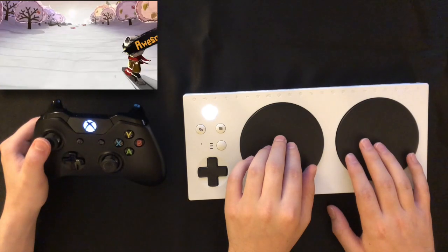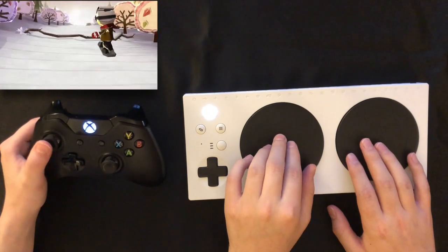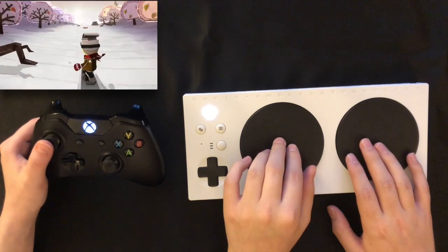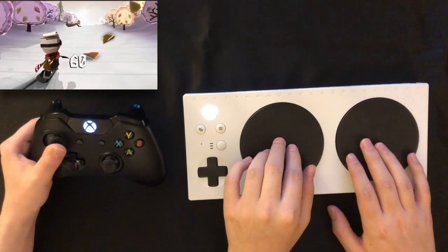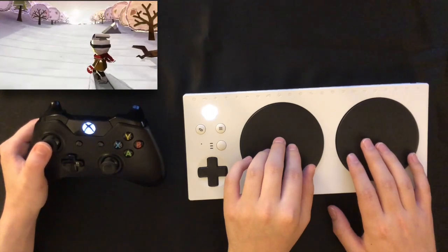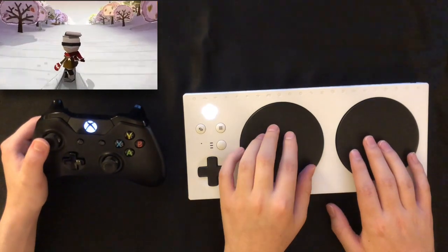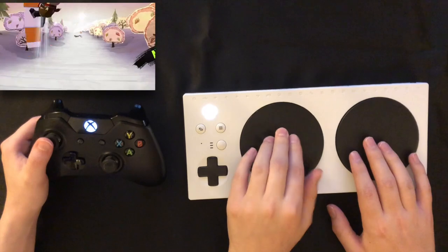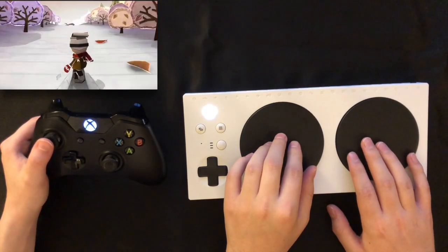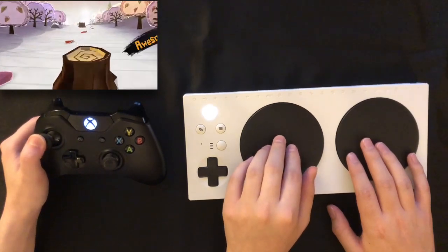In this video, Tyler directs me to move the joystick left or right while he uses the large A and B buttons on the Xbox Adaptive Controller. The addition of Copilot on the Xbox One along with the Xbox Adaptive Controller is a great way for therapists to build rapport with their clients. It is also a great way for clients to build personal relationships and to practice communicating needs and wants.